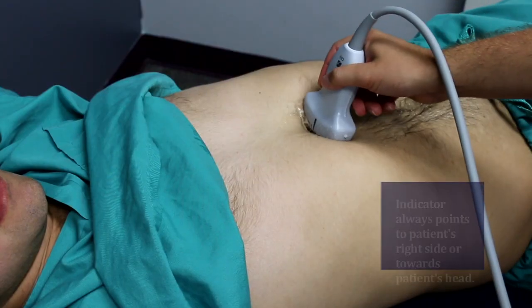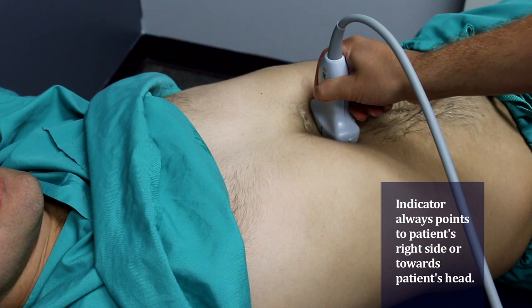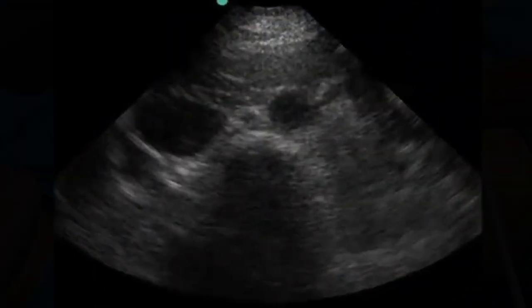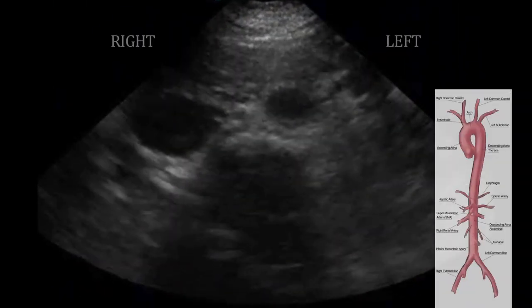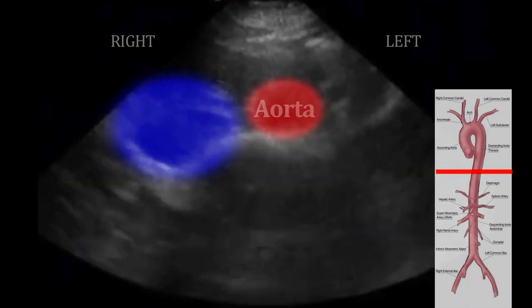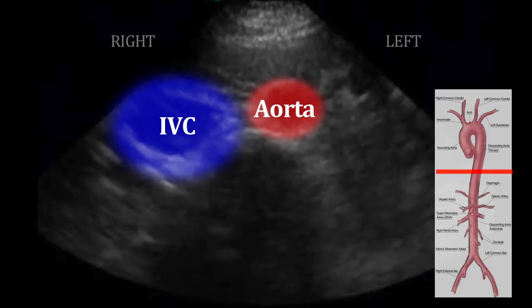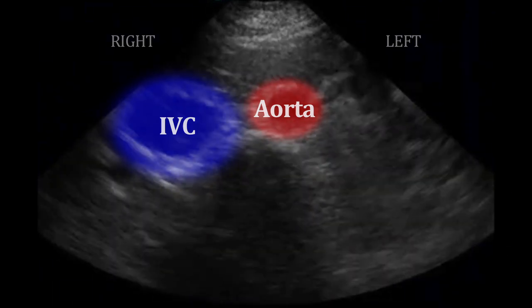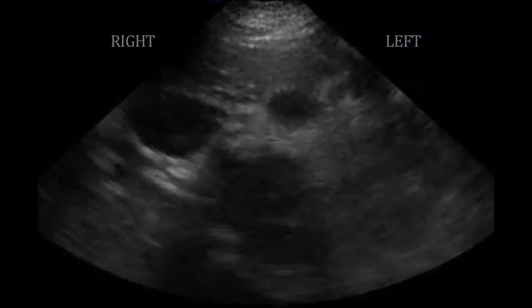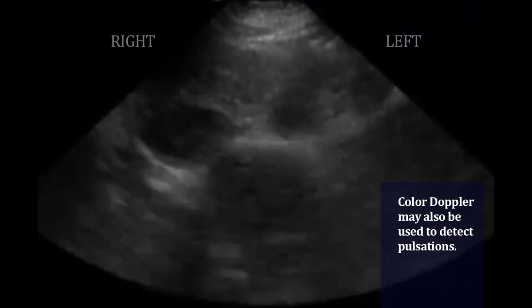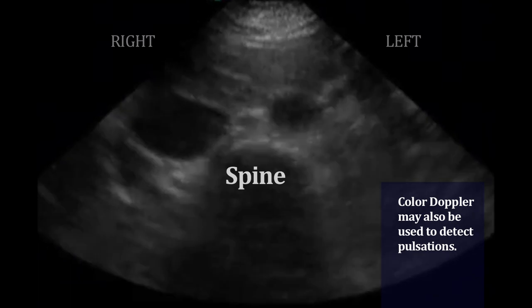We begin our exam with a short axis view, just below the sternum, to view the aorta in cross-section. Once we have this view, it's important to establish our anatomy. We see two circles here at the top of the screen, which are the aorta and the IVC. Recall that the aorta is on the patient's left, and since it's receiving blood directly from the pumping heart, it's slightly more pulsatile than the IVC.